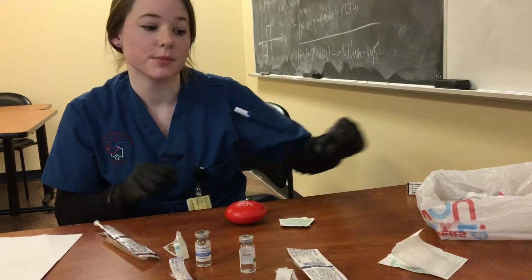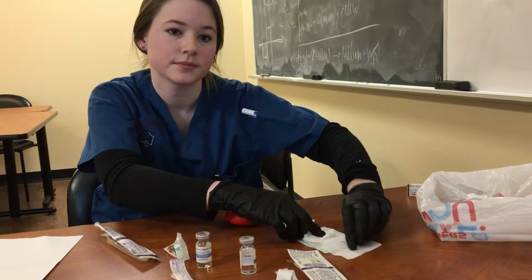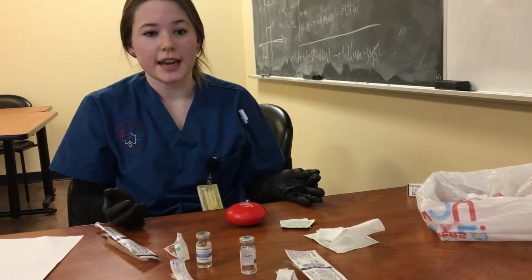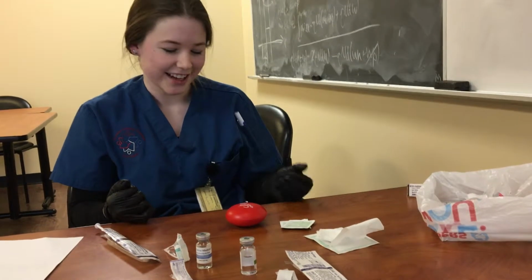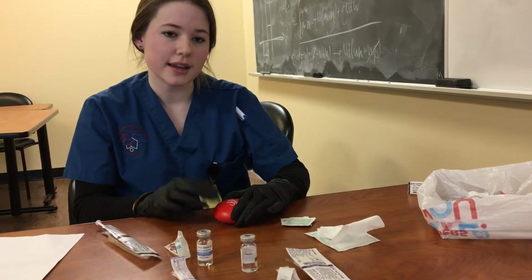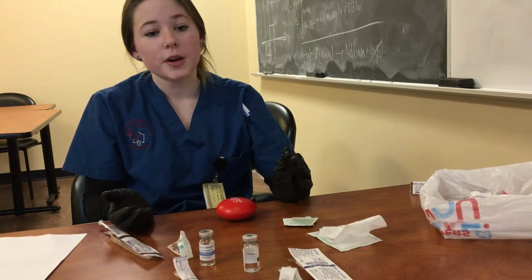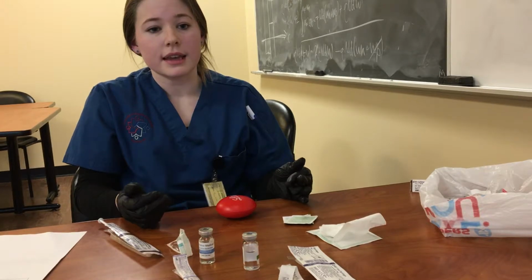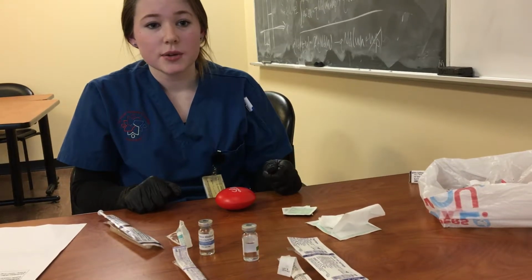And today I'm going to be using some gauze. So I have that here, just 2x2 gauze. So I'm giving a sub-Q injection today. So I just want to make sure that I landmark appropriately. So today we're going to be going in the abdominal area. I could ask the patient which side he would prefer. We could either go to the back of the arm or the inner aspect of the thigh, the outer thigh. But he said that he wanted to have it in the abdomen today, which is fine.